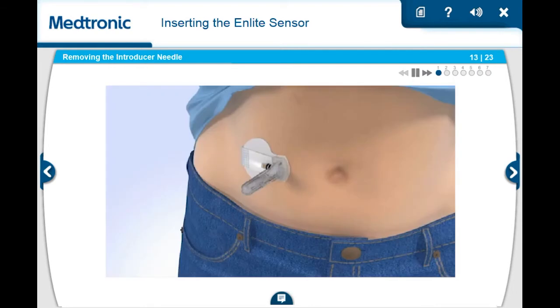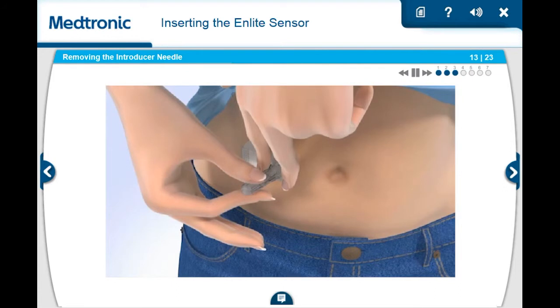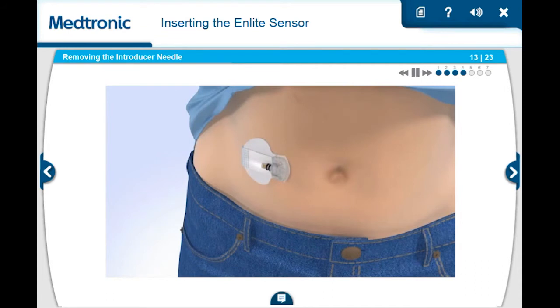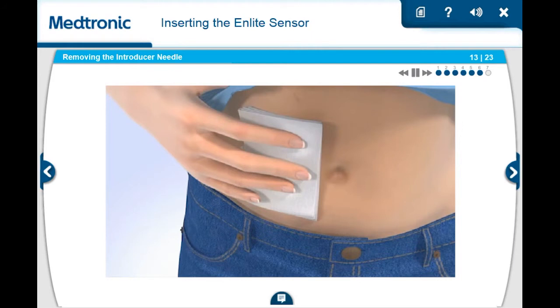With one hand, gently hold the sensor by placing one finger on the front of the sensor and one finger on the sensor connector to ensure your glucose sensor stays in place. Be sure you do not hold or pinch the sides of the sensor. With the other hand, hold the needle housing at the tip and slowly pull straight out away from the sensor. The needle automatically retracts inside the plastic needle housing. Discard the entire piece into a sharps container. Note, if bleeding occurs at your insertion site, apply steady pressure using sterile gauze or a clean cloth for up to three minutes.